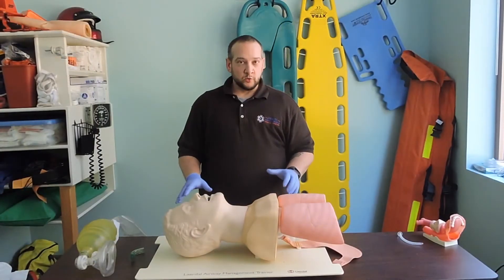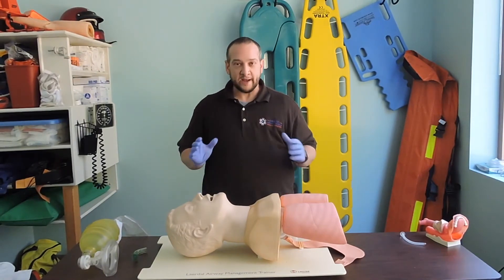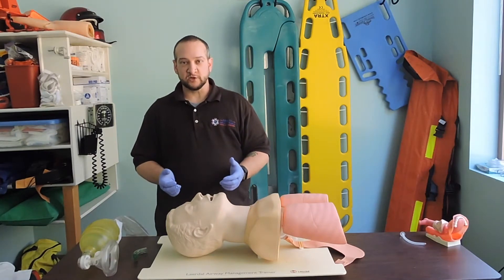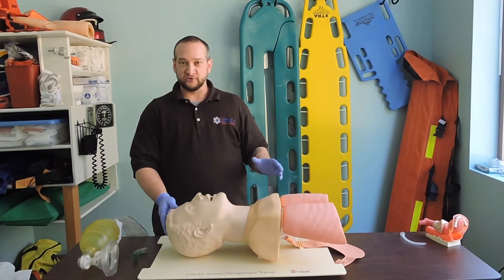Today we're going to do a very basic demonstration of our airway management assessment. Anytime we're managing a patient's airway, it's the most important thing that we can do. Without proper management of the airway, none of our other interventions mean anything.